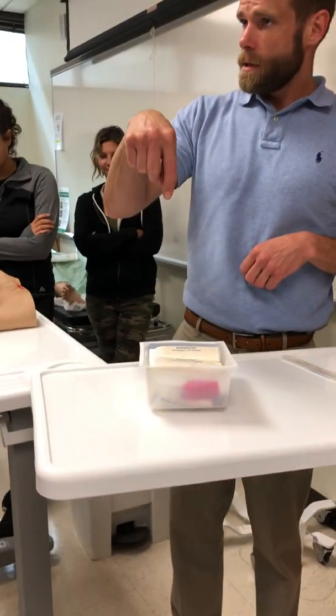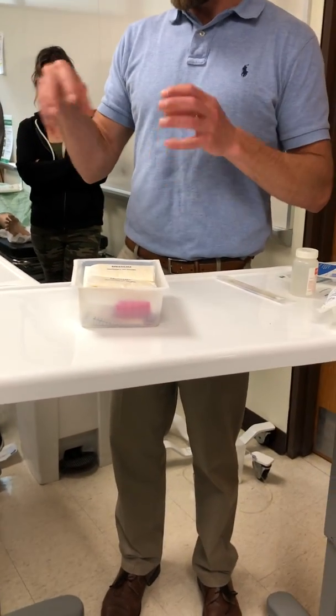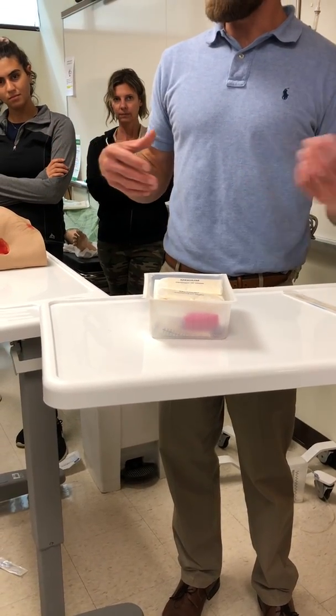Two pairs of sterile gloves. I'm going to remove the sterile gloves. Okay? Then I'm going to put the sterile gloves on. I'm going to set up my sterile field. I'm going to remove one pair of sterile gloves and then use the second pair.